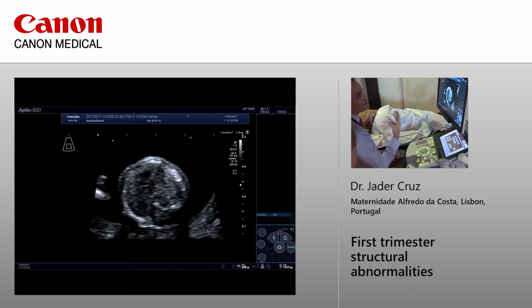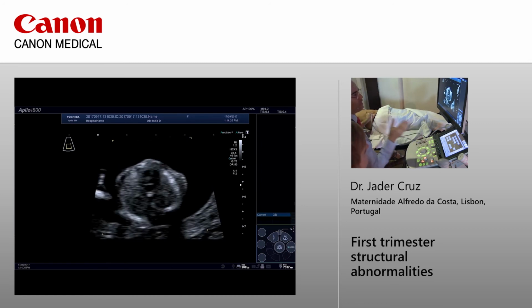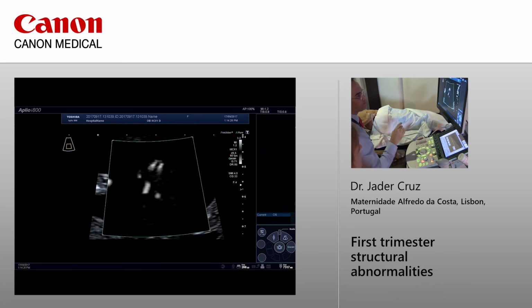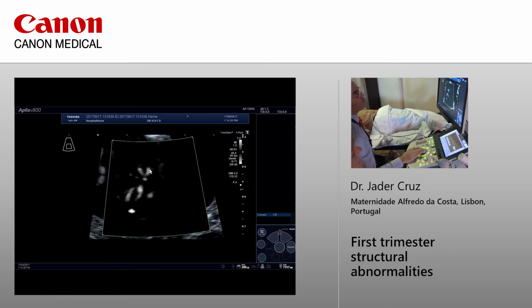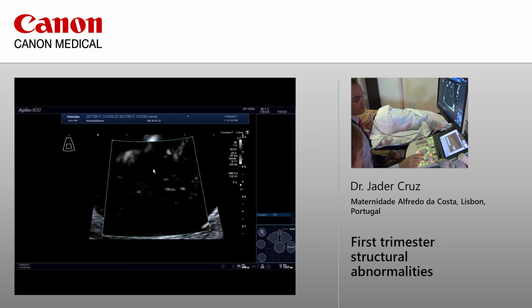And there is a new SMI. So the image I showed you was from the old SMI. I define things as new and old. They have new names for that. This is the new one. I think the definition is even better than what we had. You see the baby decided to go around. So you see the interventricular septum very well. Bye-bye, baby. Come back.